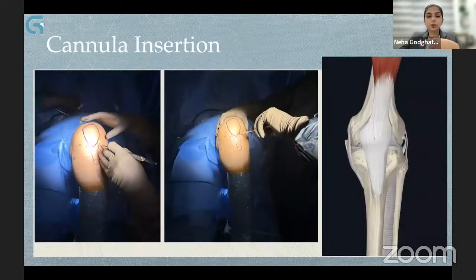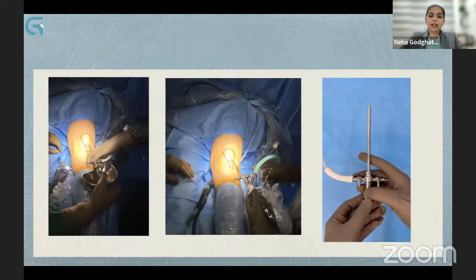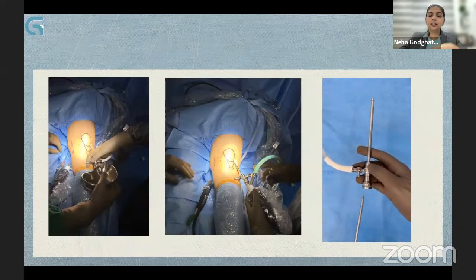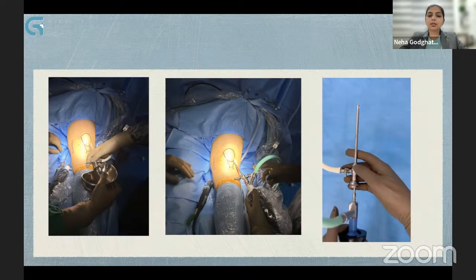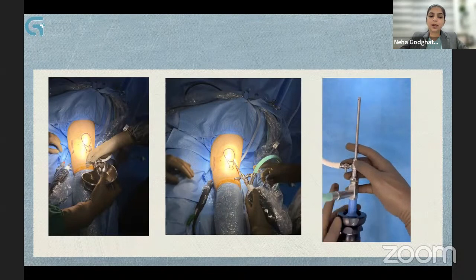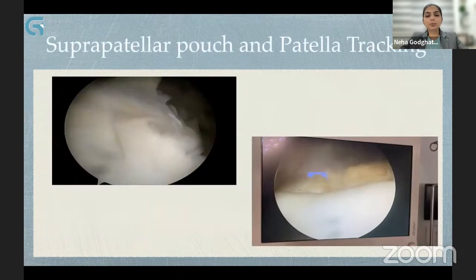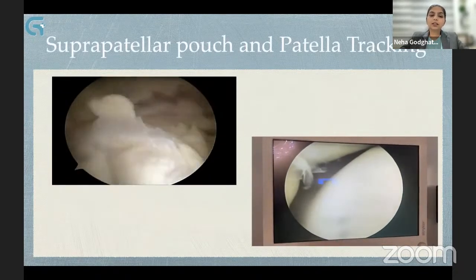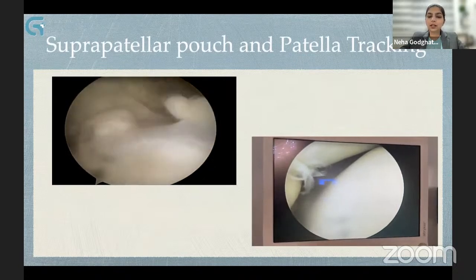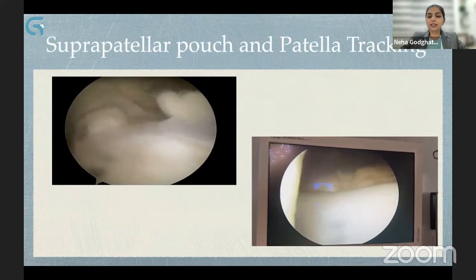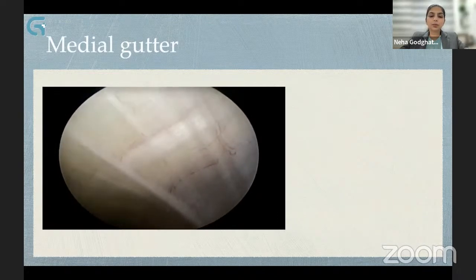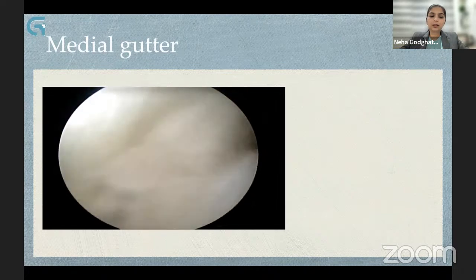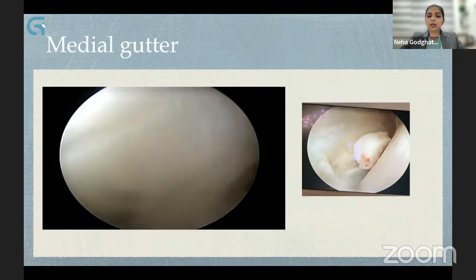Proper placement of the anterolateral portal just superior to the lateral meniscus and just lateral to the patellar tendon allows optimal visualization of the compartments of the knee. The soft spot is palpated, then an 11-blade is used to take a stab incision up to the capsule — unlike the shoulder joint where only skin is incised. A sharp edge of the blade faces superiorly to avoid iatrogenic injury to the meniscus. Then with a gradual rotatory movement the cannula with a blunt trocar is inserted until the intercondylar notch. The knee is extended, and the cannula is advanced into the suprapatellar pouch. The trocar is withdrawn and the arthroscope optic system is inserted.